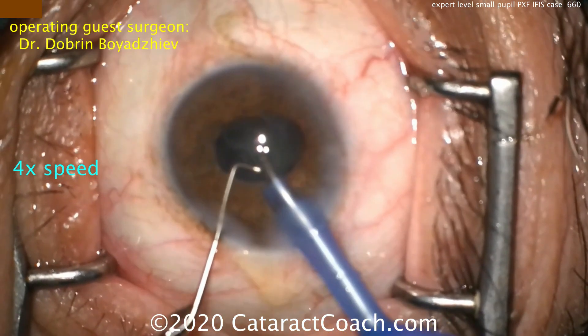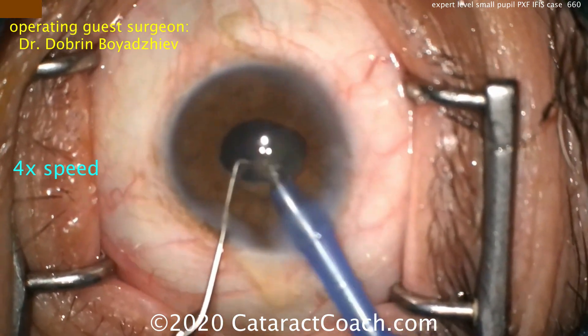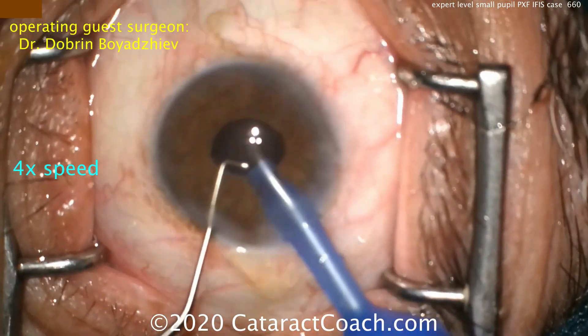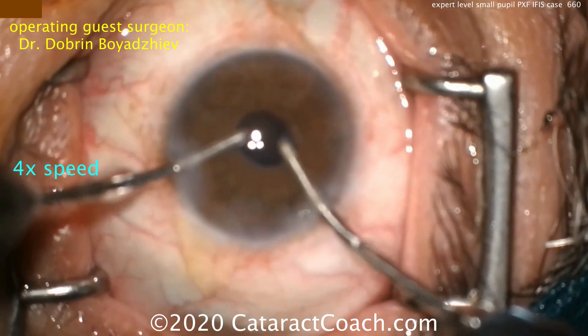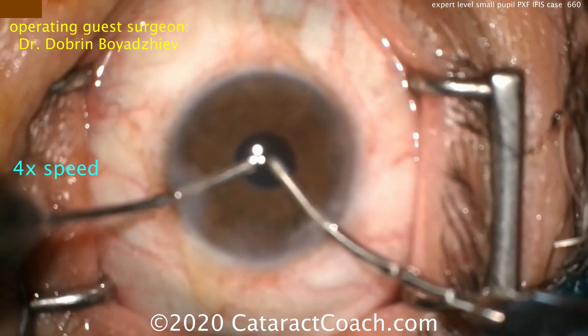The surgeon is being very careful to stay in the very center of that pupil at the iris plane to slowly and carefully remove all of the nucleus. This is a tough technique — if you're a beginning surgeon, this is not recommended for you. Using bimanual irrigation-aspiration to remove the lens cortex.